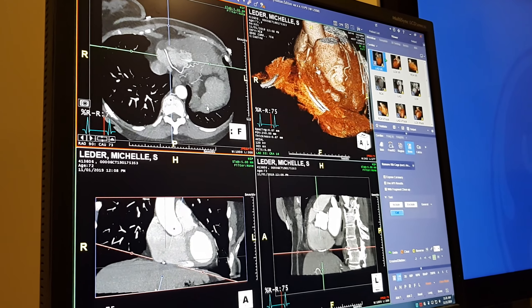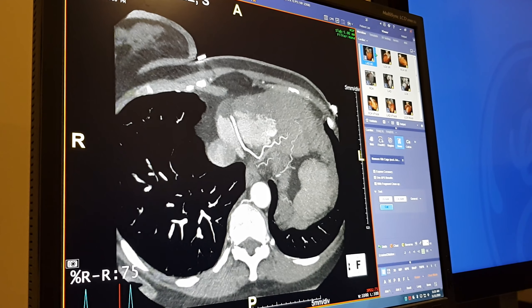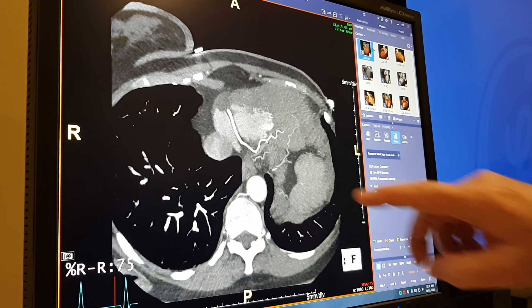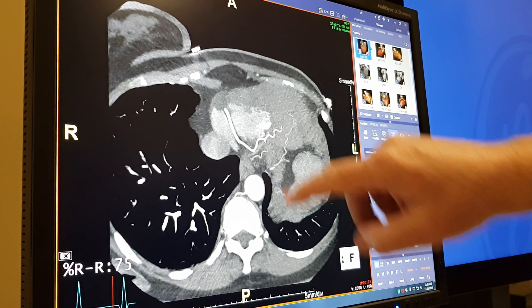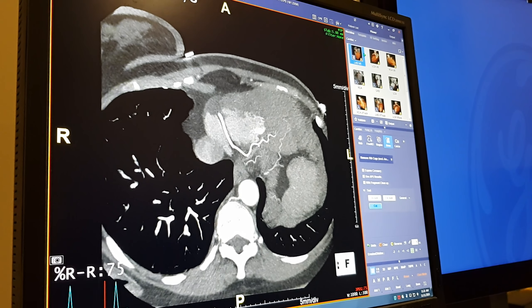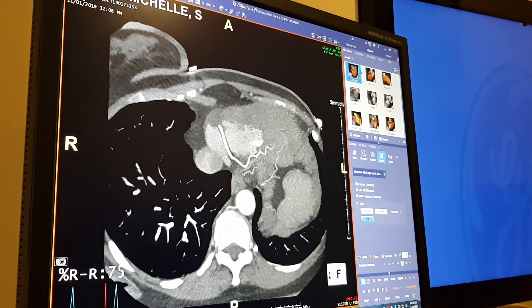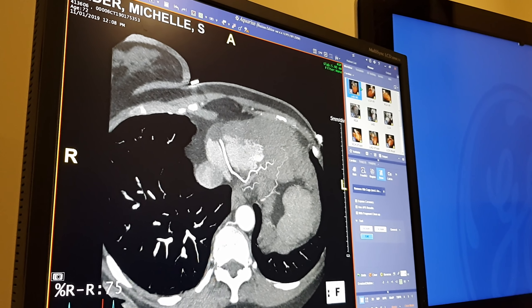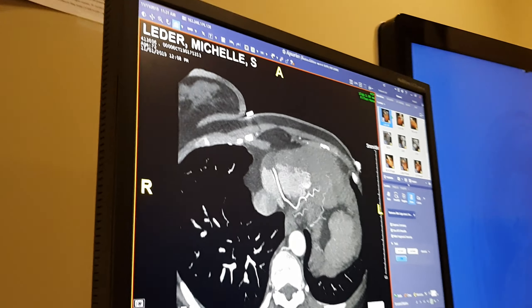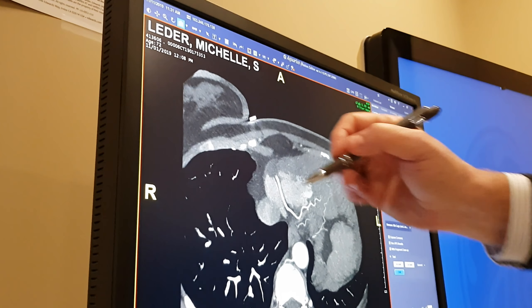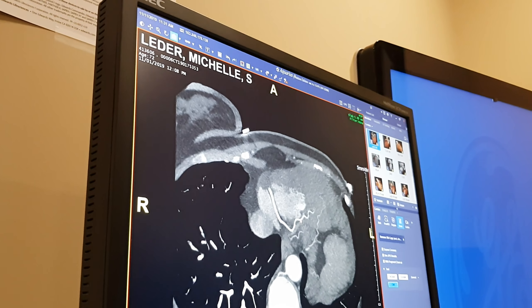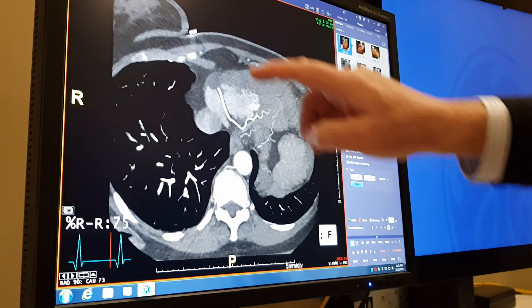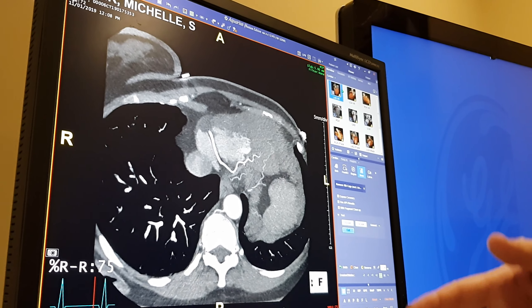Here we go — look at that. This is a nice big open artery. If this is your highway, like 285 or 400, all lanes are open. If you have a blockage, what you end up seeing is white — the contrast — and then a dark spot, which is the blocked artery area. You don't have that. Normally, as your arteries come down, they get smaller — that's a normal appearance.